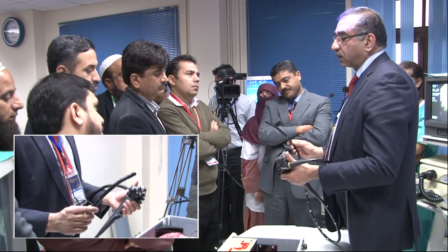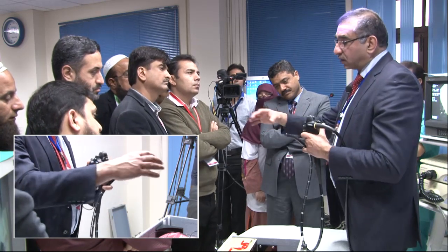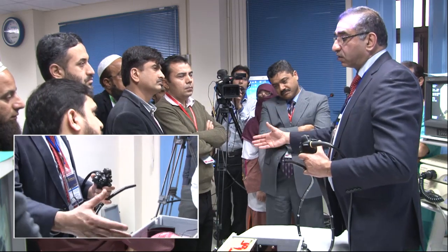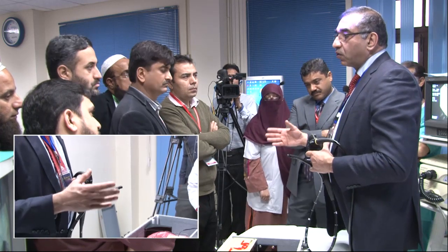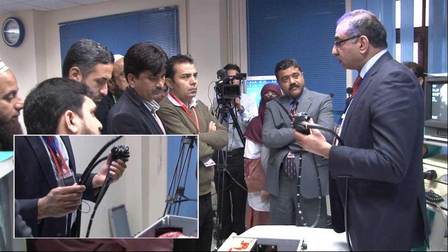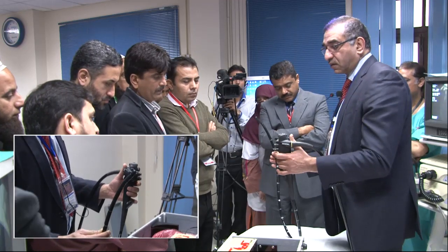Keep it away from there, because the more you inflate, you wouldn't see it being inflated because it's an open channel. The air will keep going down into the intestine, even to the colon, and the patient will become more and more distended. So always resist the temptation of putting your finger there. Keep it away from it if it's not needed, right? And so that's your duodenoscope basically, right?